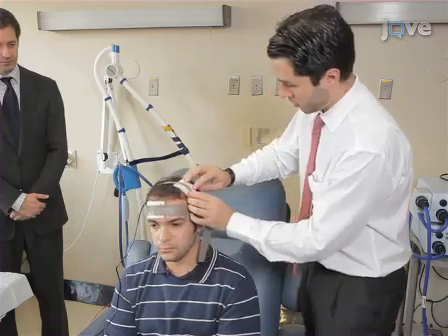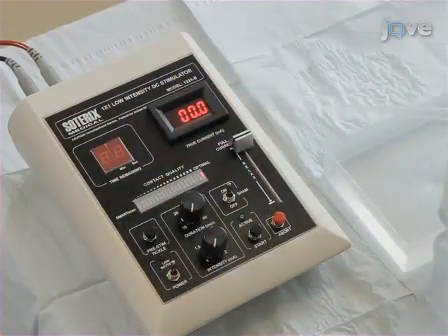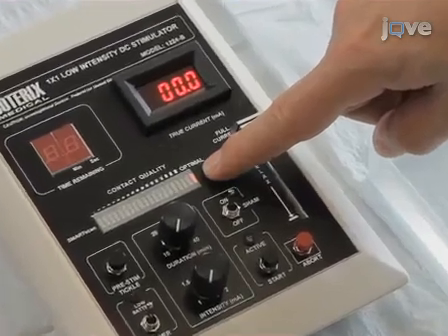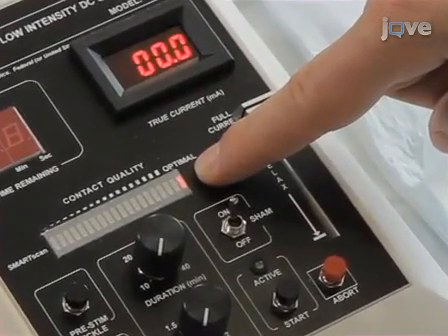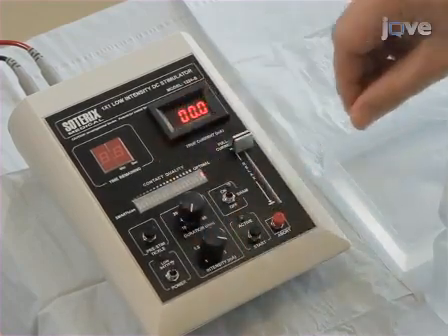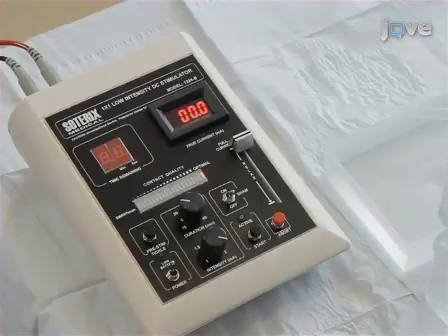Assure that the sponges are not excessively wet but moist enough to have good electrode contact. Turn on the TDCS device. Use your system to measure the total resistance, being the sum of electrode and body resistance. If the overall resistance is abnormally high, this may indicate improper electrode setup. Ideally, aim to have the impedance under 5 kiloohms. Adjust the settings for stimulation including the intensity, time, and if applicable, the sham condition setting. Here, a reliable setting for pain treatment is used: stimulation at 2.0 milliamps for 20 minutes.